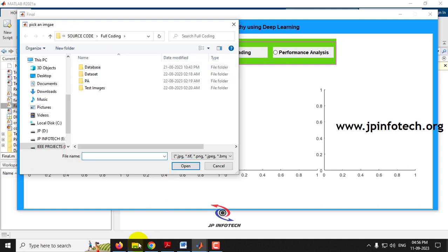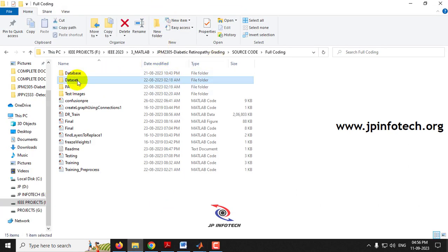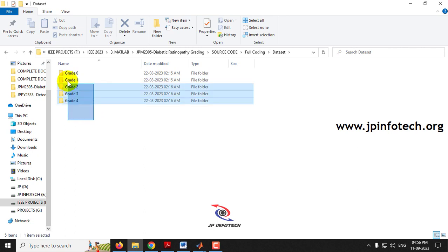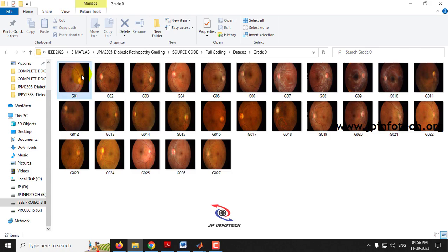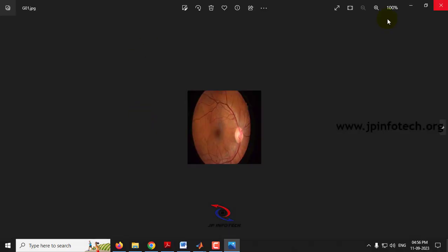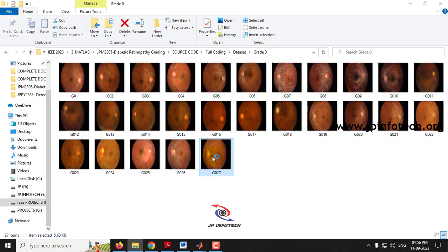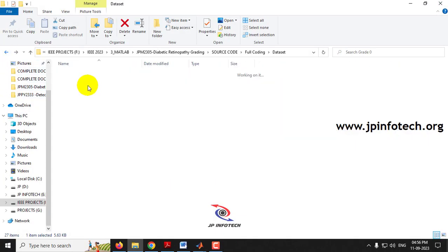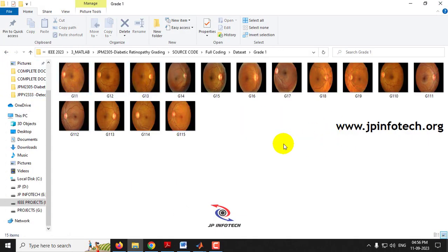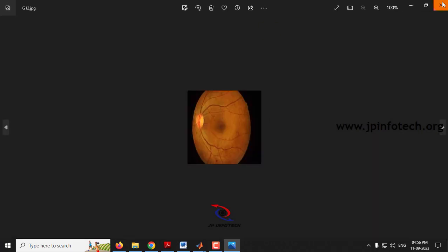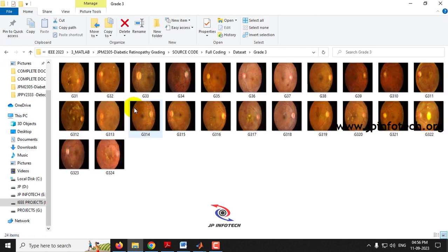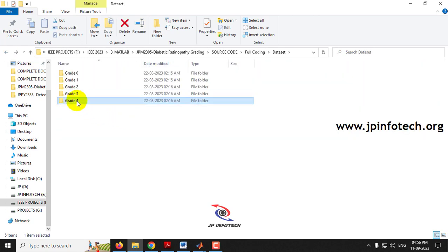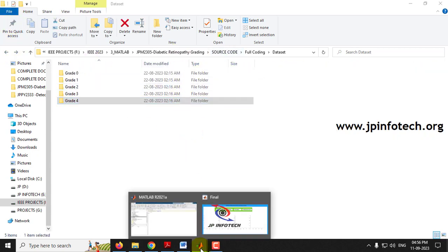Before selecting a test image, let me show you the dataset. The dataset folder contains five grade folders — Grade 0 through Grade 4. Sample training images are shown for each grade, including Grade 0, Grade 1, Grade 2, Grade 3, and Grade 4. These are the images the system has been trained on.